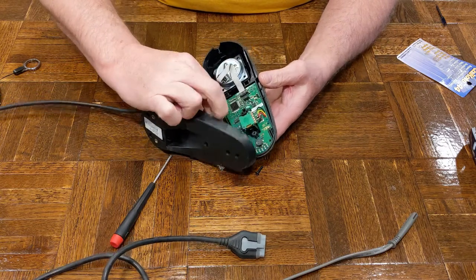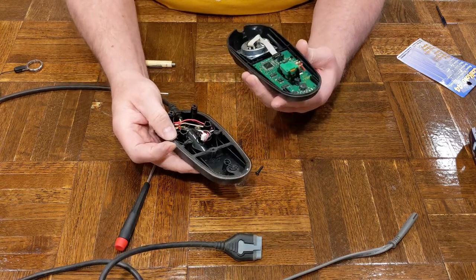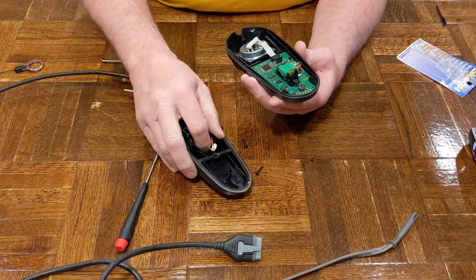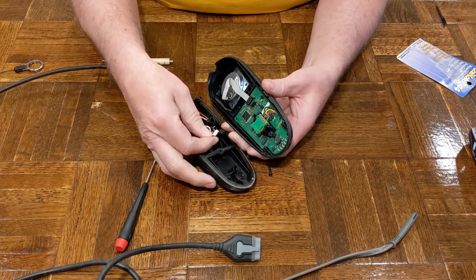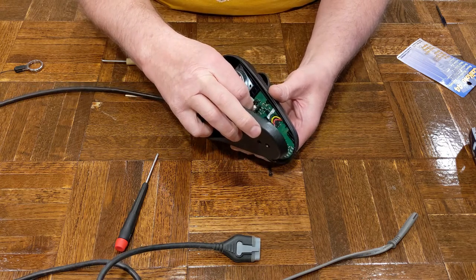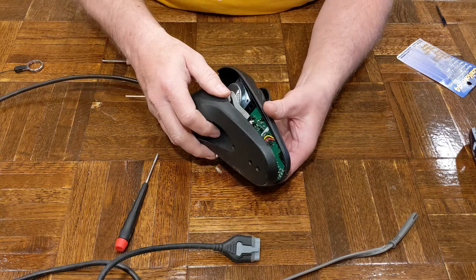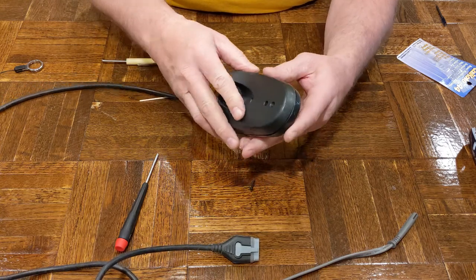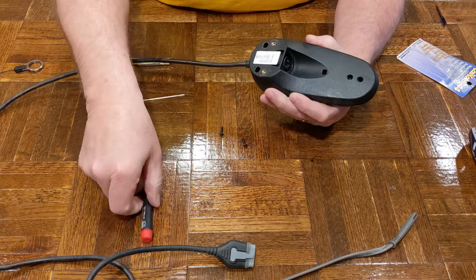We just need to connect the back by pushing this connector back into place, and then install the three screws — these are the Torx T10s.